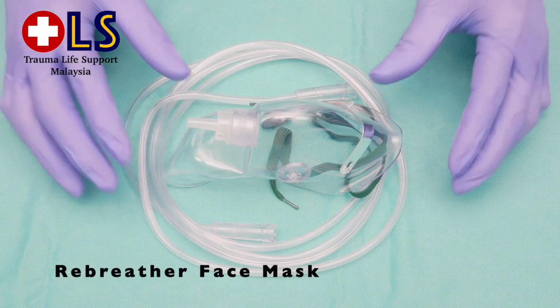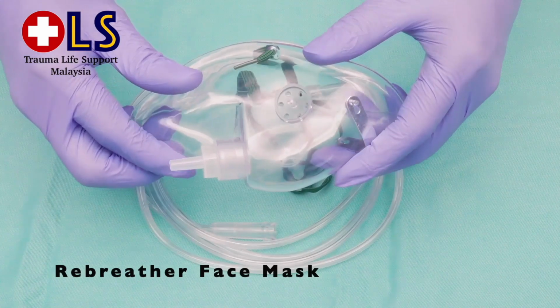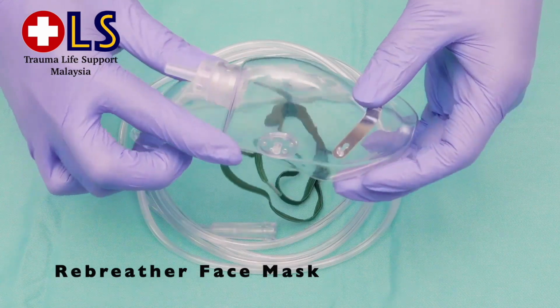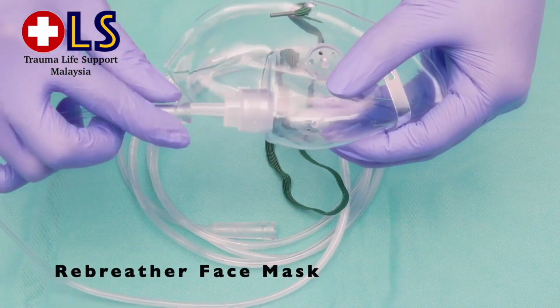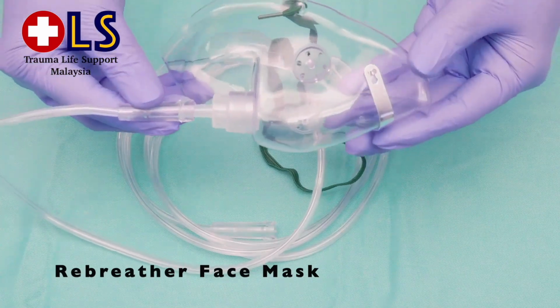This is rebreather face mask. It is used to deliver higher concentration of oxygen at the higher flow. After connecting the tube to humidified wall oxygen supply, set the flow 5 to 10 liters per minute, which delivers oxygen concentration from 40% to 60%.